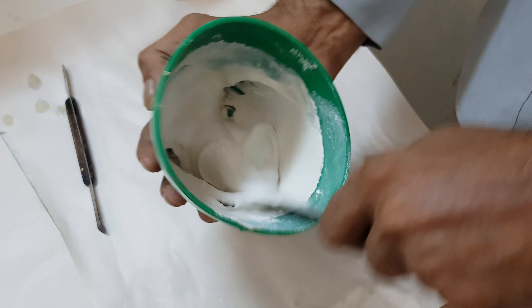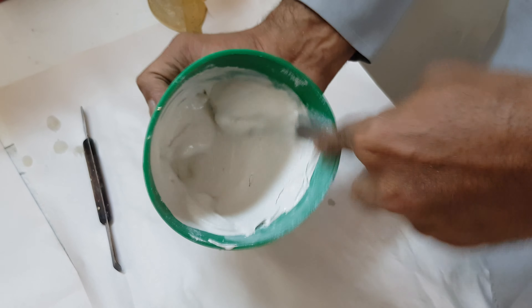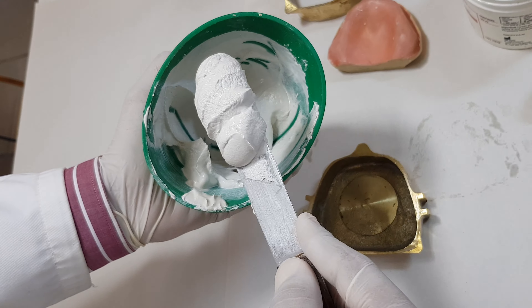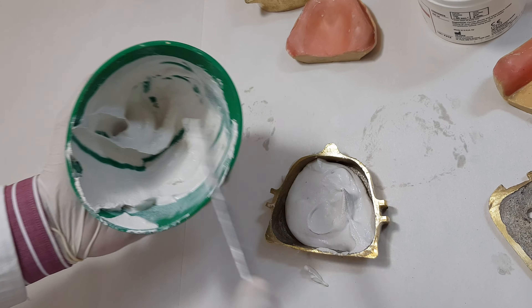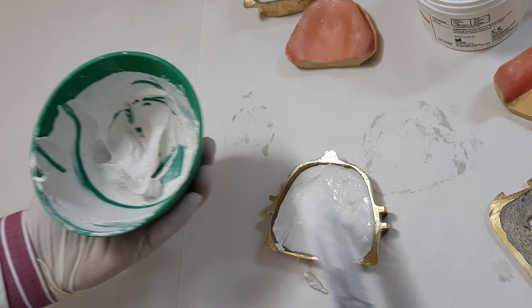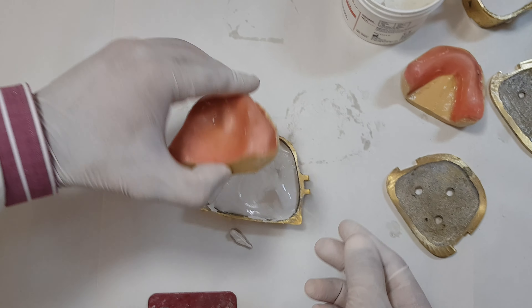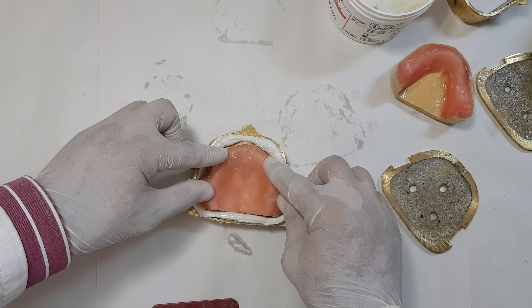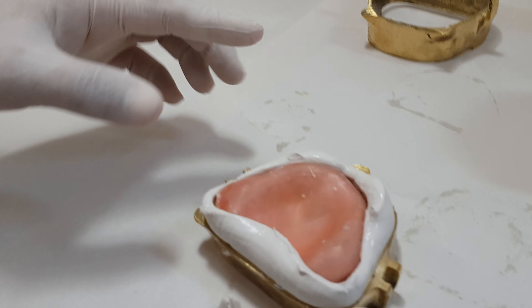Plaster is being mixed to a thick creamy consistency. This is type 2 dental plaster. We'll place soft plaster in the lower chamber. After that, the cast is placed here and centered, pressing it in gently. We've decided it's not going to go all the way to the bottom — only a small amount of material is kept on our side.